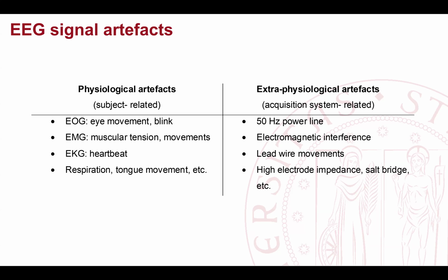So we may have, and we already saw that, for example, an overlap with the EEG activity from the so-called electrooculography, EOG, which is basically activity of the eye. Not only the blinks, these huge peaks that we've seen in the very first slide, which are normally related to the contraction of the muscles when you blink, but also even eye movements.